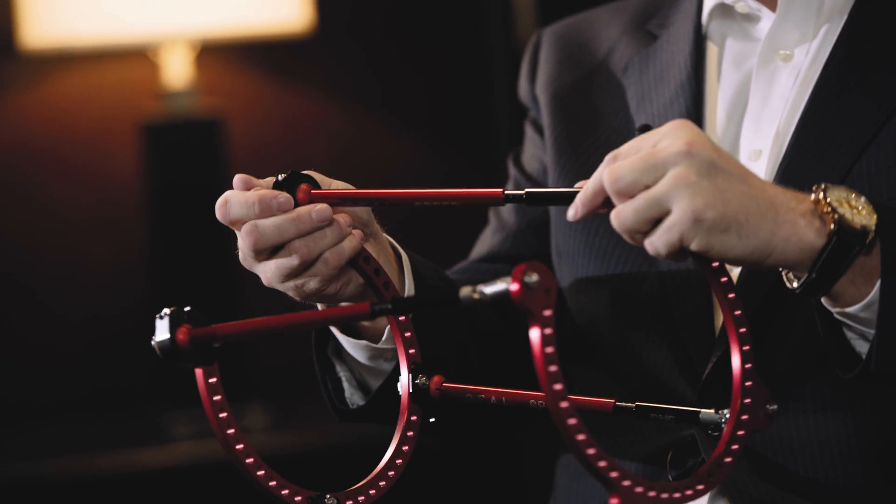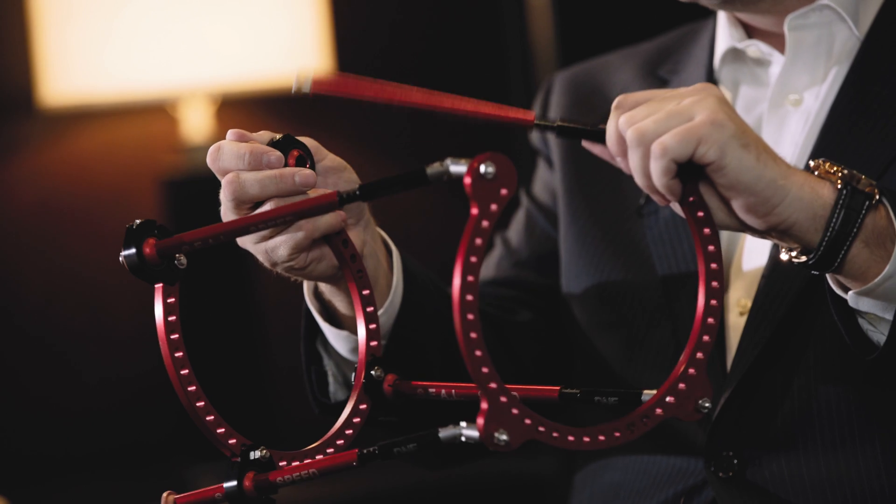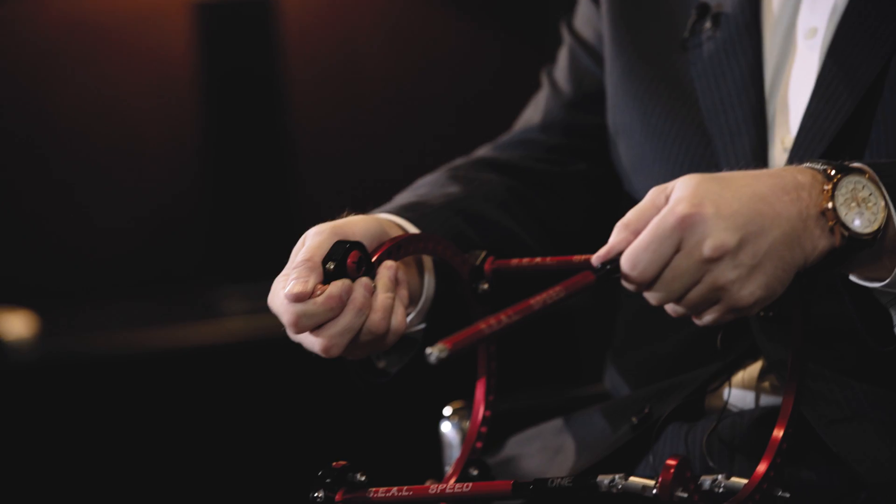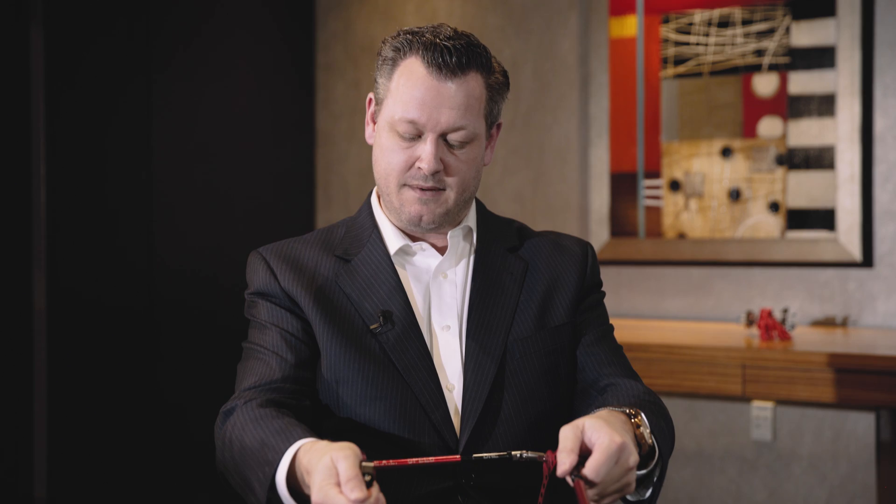Additionally, these struts will allow you to compress, distract, and statically position the frame. You can actually remove a portion of the strut on the bottom, remove pieces of the strut to bend them out, and get full or improved exposure to the anatomy for fixation via wire or pin.